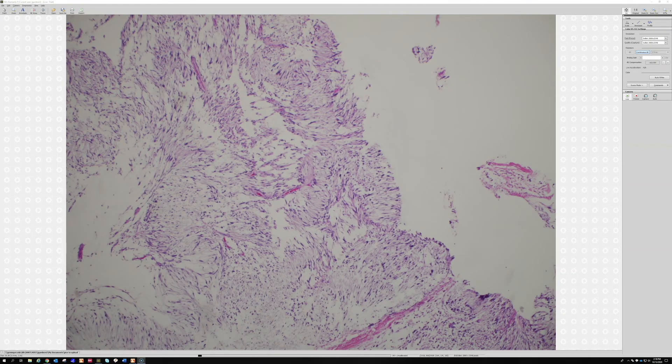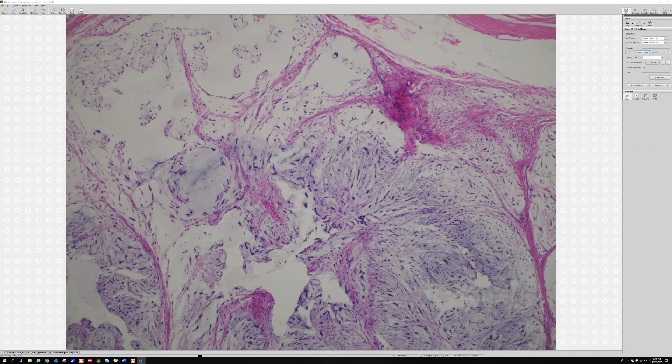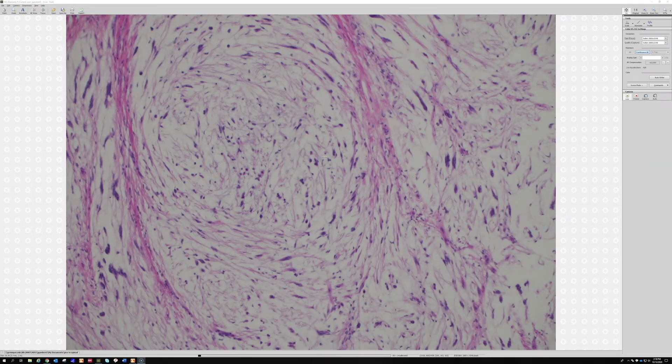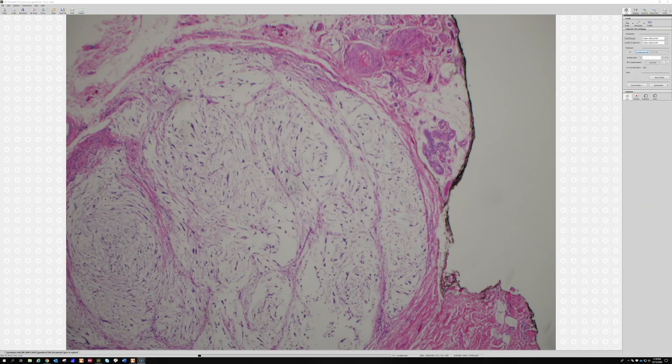The schwannoma-like palisade appearance is only a minority of cases. What's more characteristic is this: you get spindle cells that kind of swirl around in a loose myxoid background — spindle cells following each other in irregular rows, spinning around, kind of running around in circles in a big field of myxoid matrix. It's this big whirling, swirling arrangement of spindle cells in a myxoid background. This is a nerve sheath myxoma, and they are benign.